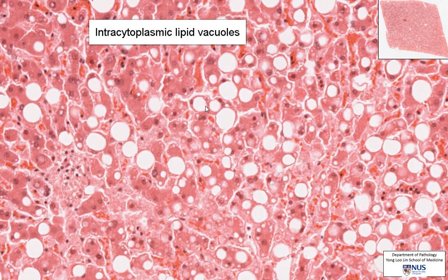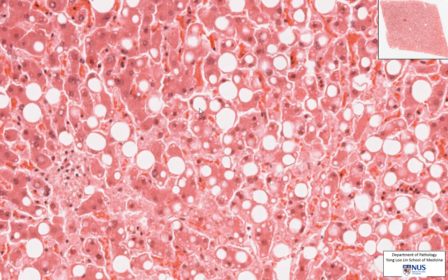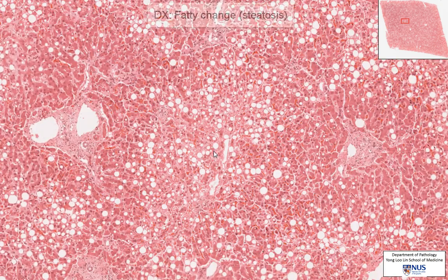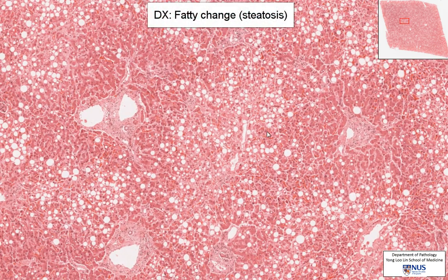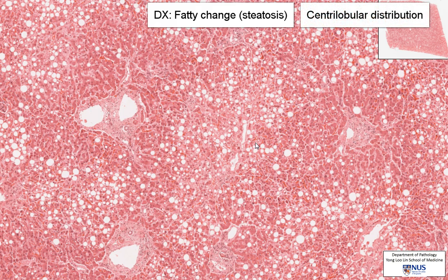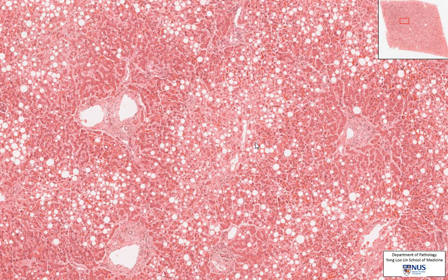The lipid usually washes out during processing of the slides because we use fat solvents. So what we see is this remaining empty space, and it pushes the nucleus of the hepatocyte and the rest of the cytoplasm to the periphery. And this is the reason for this pale area. So what we are seeing is actually a fatty change or steatosis, and this is one of the responses of cells to some sort of metabolic stress.